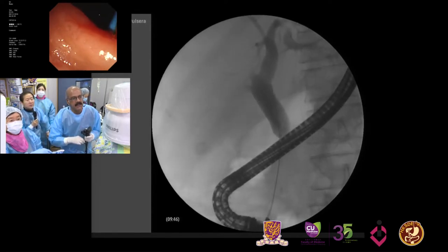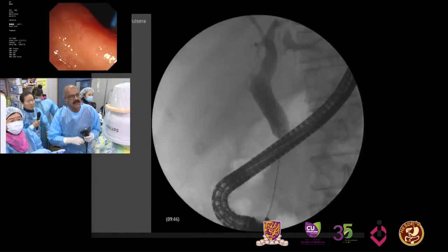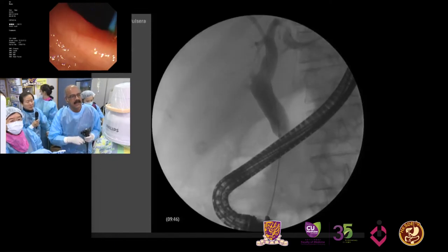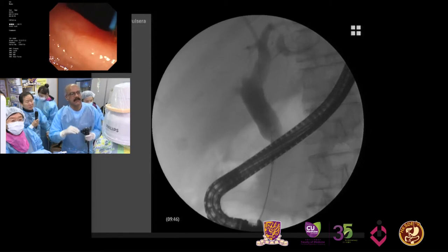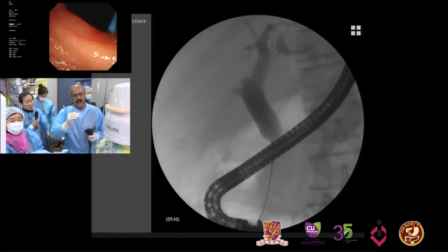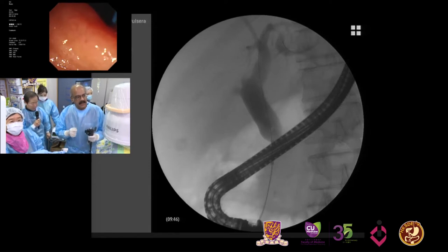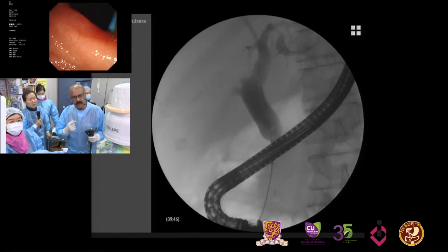If you put it more than the top into the bile duct itself, that is wrong. Then you won't get a good burn. So you have to get it right into the stricture, exactly the top part, because the amount of injury that occurs over the electrode is also a few millimeters. So you cover the stricture. The placement has not been given much importance, but it's very important to learn that.